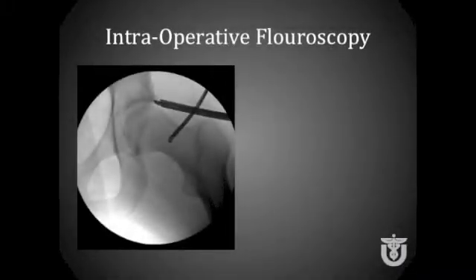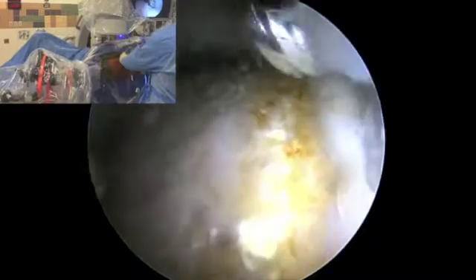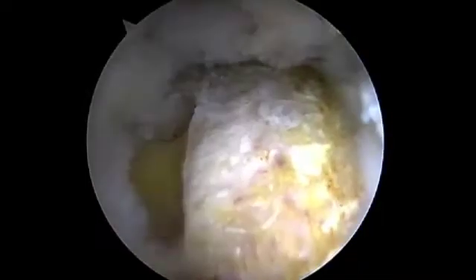Intraoperative fluoroscopy can be used to help identify the CAM lesion and the amount of resection needed to restore adequate offset. With the extremity in extension and slight internal rotation, the trough is begun at the superior location of the CAM lesion. I typically step off the defined edge of the CAM lesion by 8–10 mm using the width of the burr as a guide. I find it important to continuously visualize the edge of the head-neck junction so that the trough can be placed parallel to the defined edge.